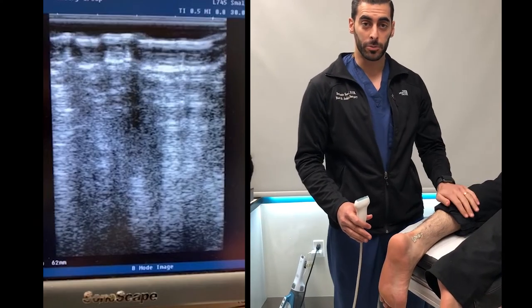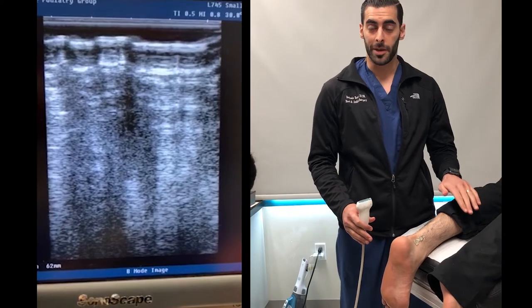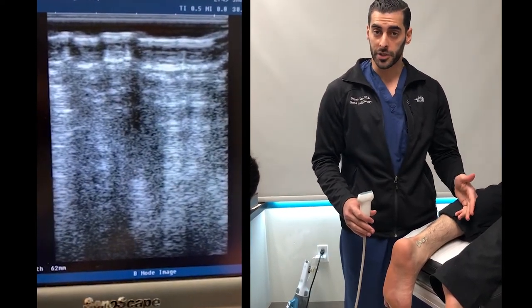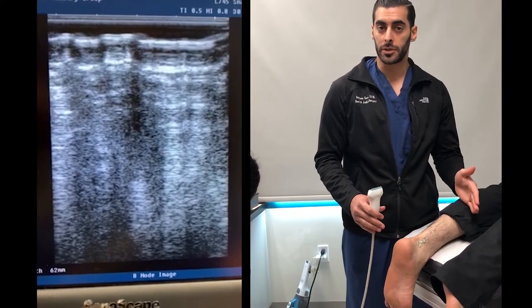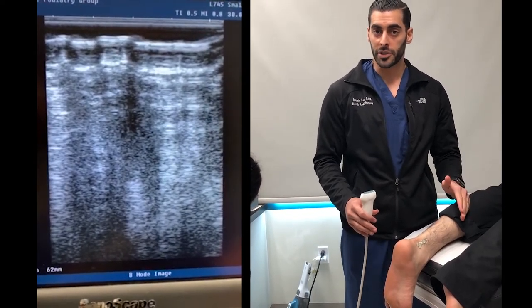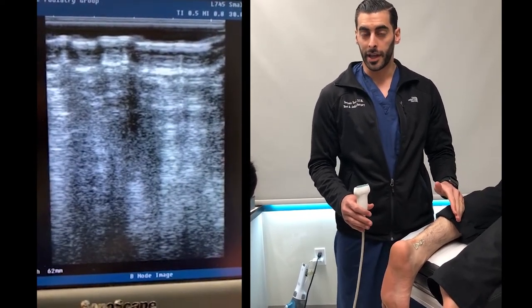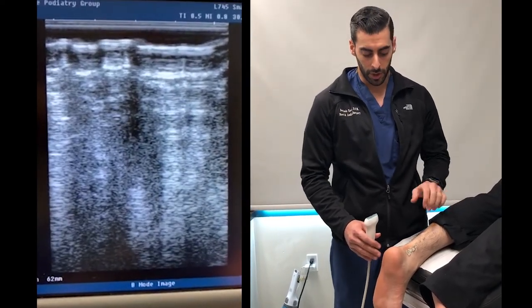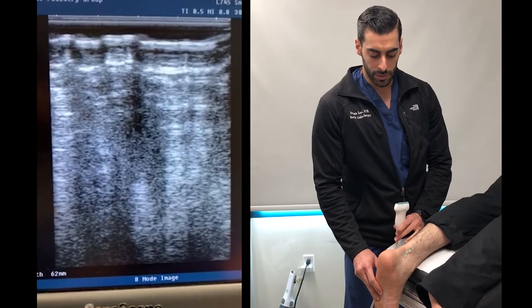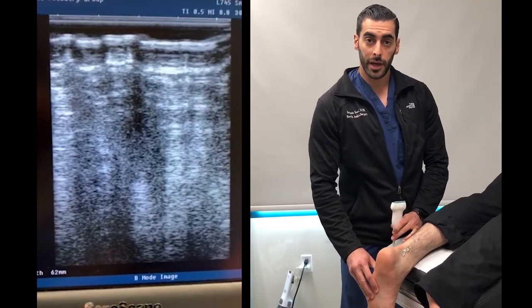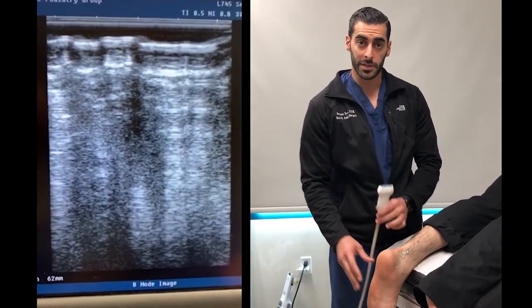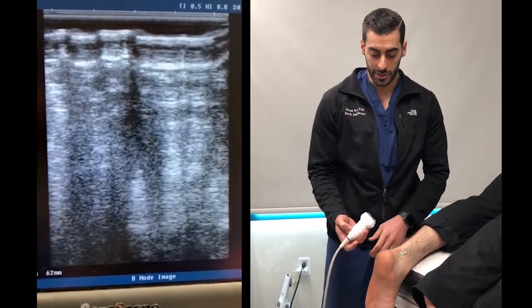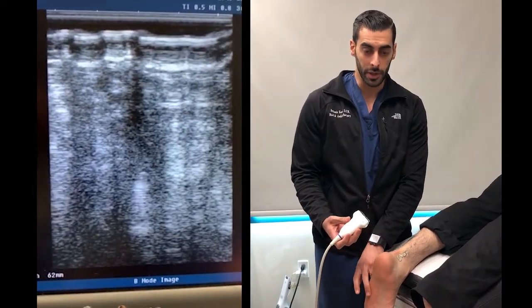As you can see here, we have the patient in the prone position, which I believe is the easiest. You can do it in the supine position; however, it may be difficult to position the patient's foot and to gain good access to the Achilles tendon. Here you can see the patient's in the prone, and we can easily dorsiflex the patient's foot, which is important because this type of imaging has a dynamic component, which is useful.